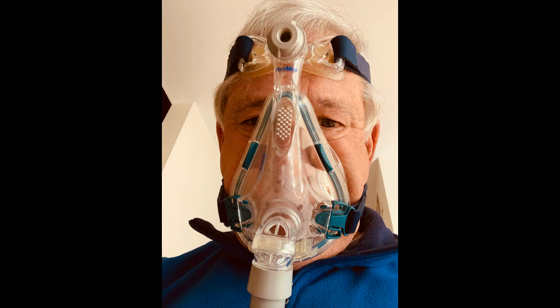Note the small holes between my eyes and the mask that leak air. The air leak can be seen in this video.